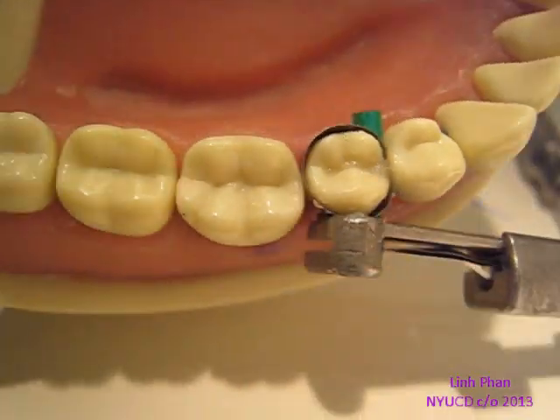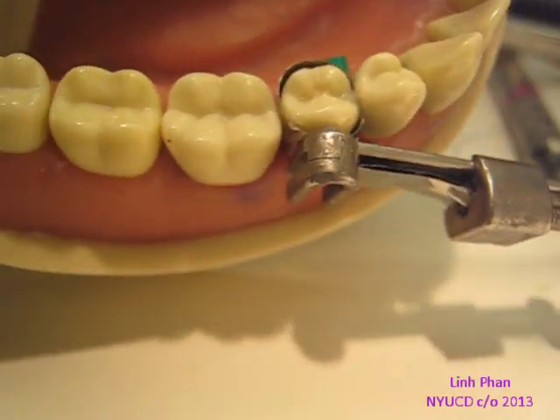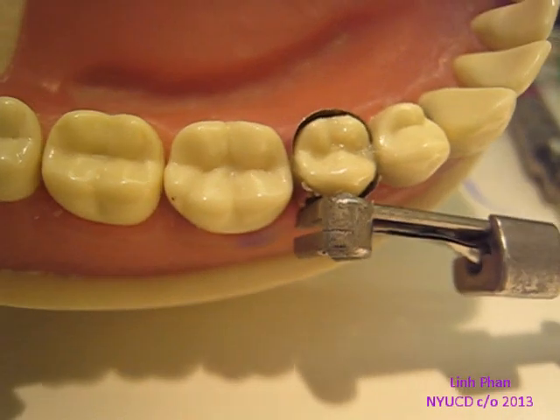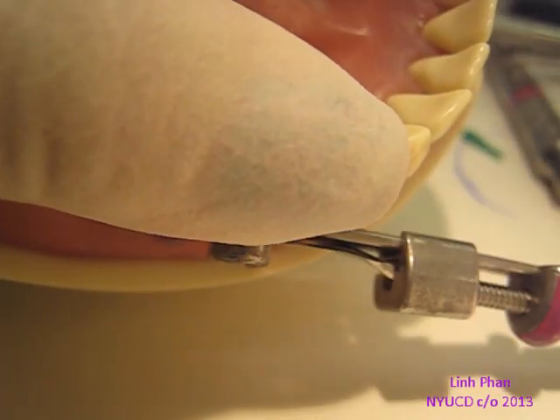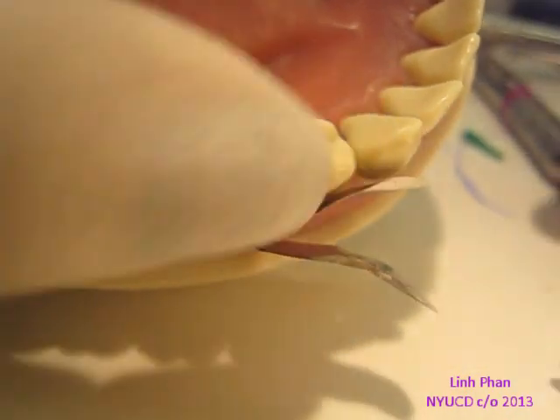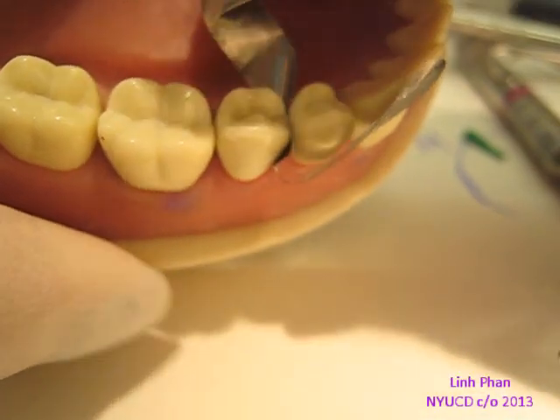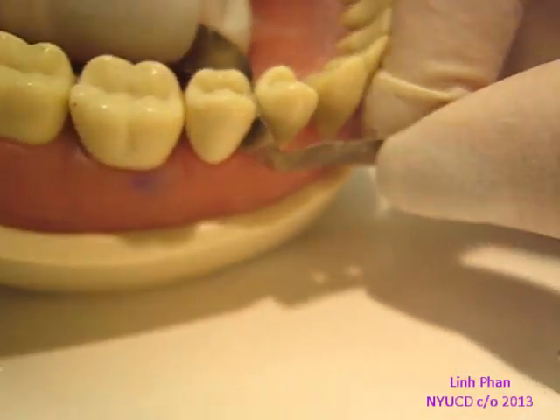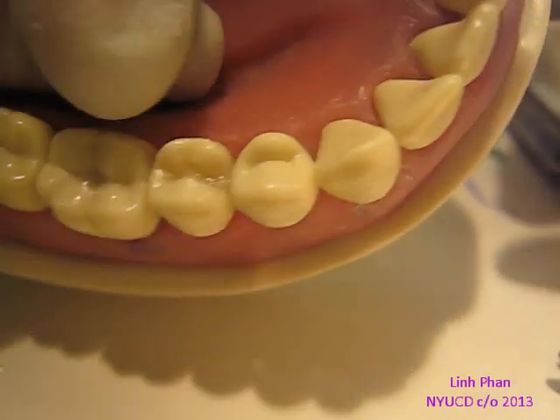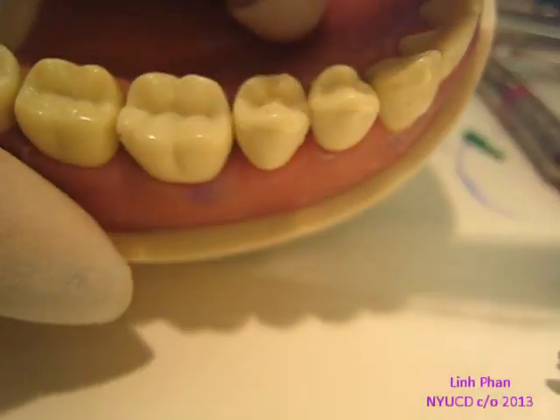Now that we have everything filled and cured, we're going to go ahead and take off the band. It's not as sensitive as an amalgam is, but you still have to be gentle. We're going to take off the band and check for overhang. First, when you take it off, because you've had a band on this whole time, you want to make sure the interproximal area is cured. Cure once from the lingual and then once from the facial.